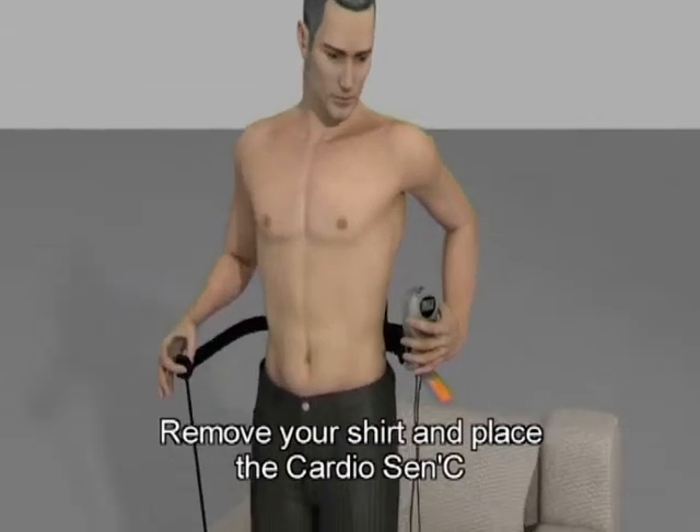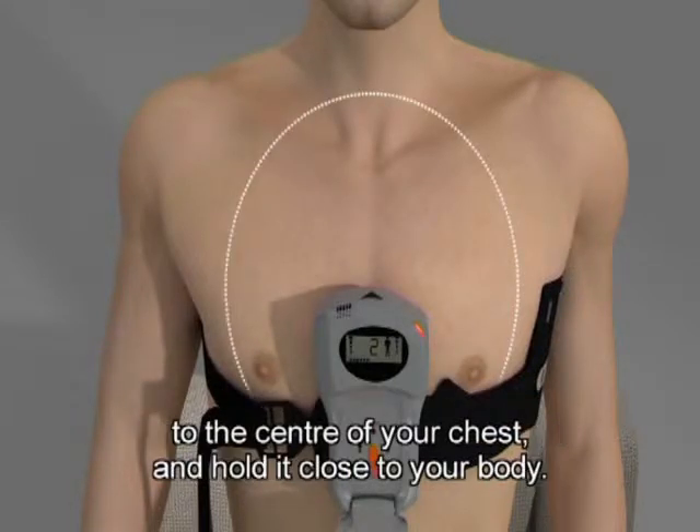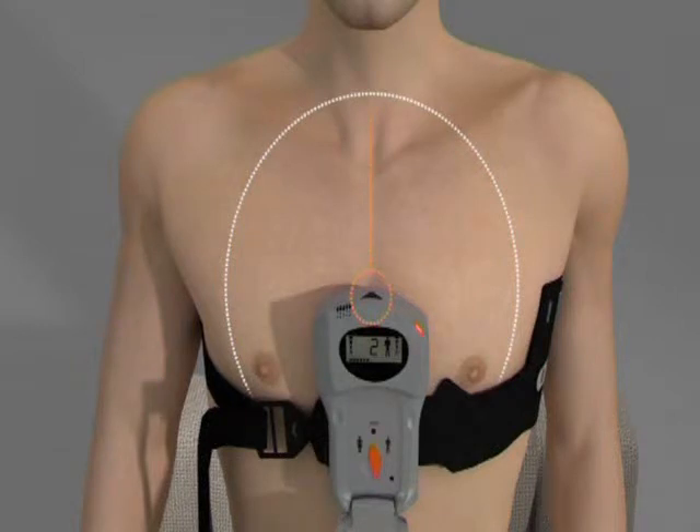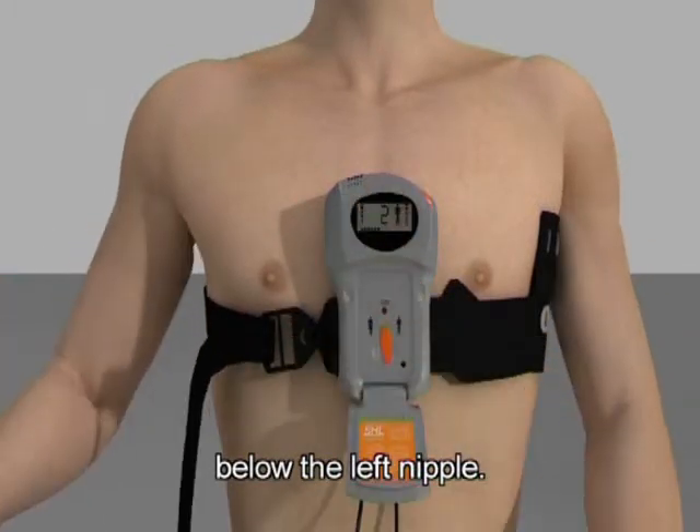Remove your shirt and place the Cardio Sen'C against the centre of your chest, with the arrow pointing up at the centre of your chest, and hold it close to your body. Wrap the electrode belt around your chest below the left nipple.